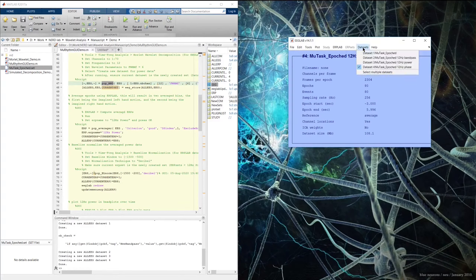We're going to compute the mu ERD by first averaging all of the epochs for the left and right imagined motor movements using ERPLAB. So we go to Compute Average ERPs, hit run, and name this new dataset '12 Hz power.' Now we have this 12 Hz power average ERP set with two bins — one bin being the left hand and the other being the right hand imagined motor movement — but we're still in units of microvolts squared.